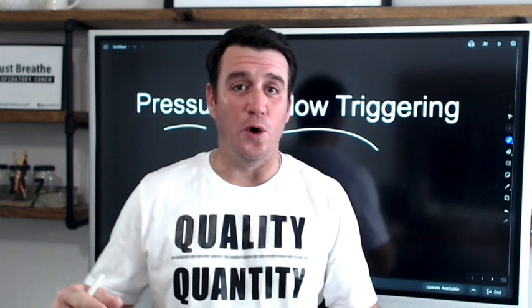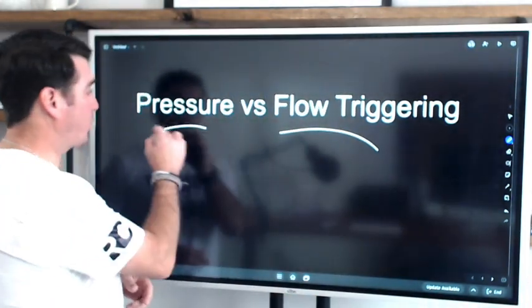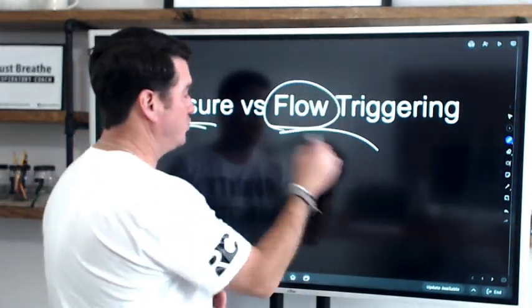Now, before we jump into it, we know that during mechanical ventilation, anything that starts the inspiratory phase is called a trigger. The ventilator can initiate an inspiration based off of a time trigger. If it's not a mandatory ventilator-controlled breath, time triggered, then it is going to be initiated by the patient. The two most common ways this happens is through a pressure trigger or a flow trigger.